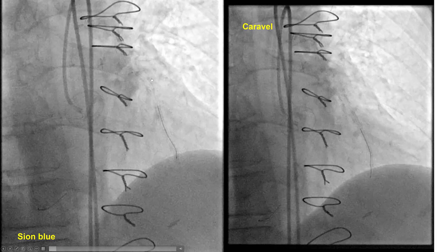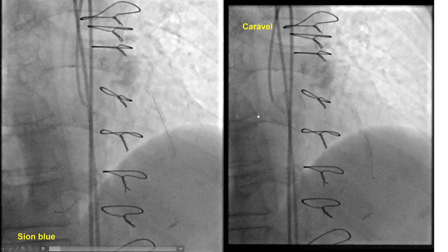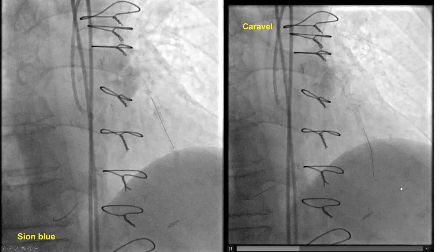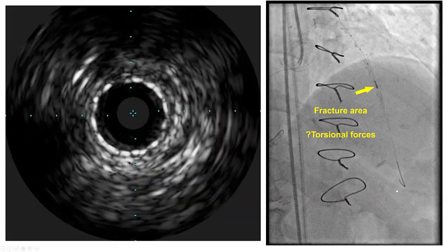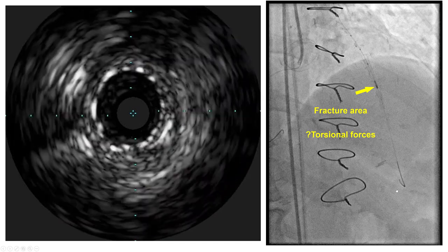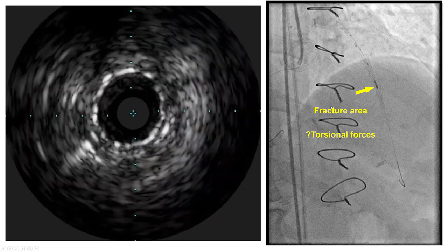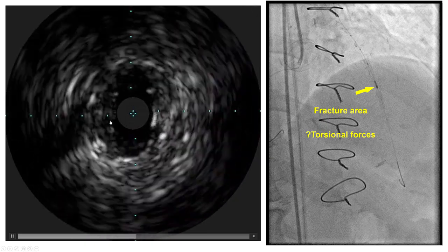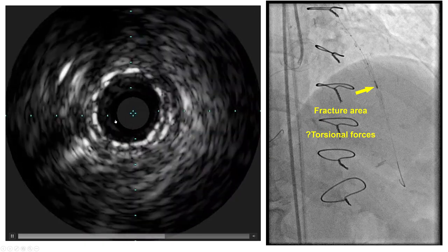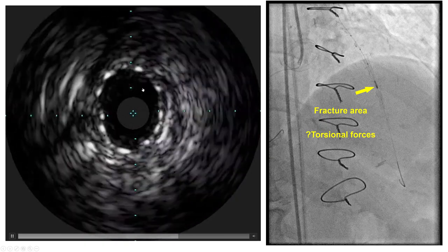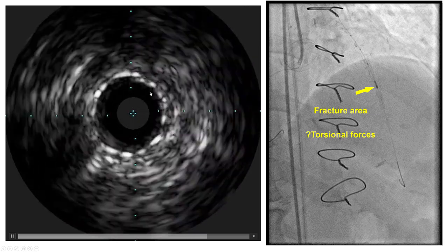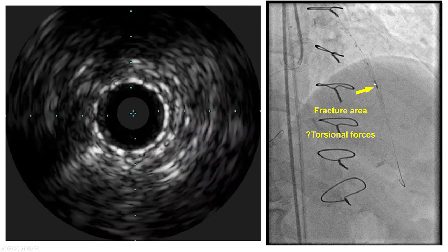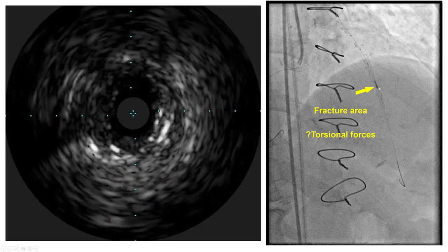Wiring was easy using a workhorse Sion Blue guidewire. We still used the microcatheter for support, but the wire was fairly simple without any difficulty. We then performed intravascular ultrasound to examine this area. IVUS demonstrated an area of gap within the previously placed stents, as well as some external compression of the vessel seen in those frames, corresponding to that segment of the previously placed stents.